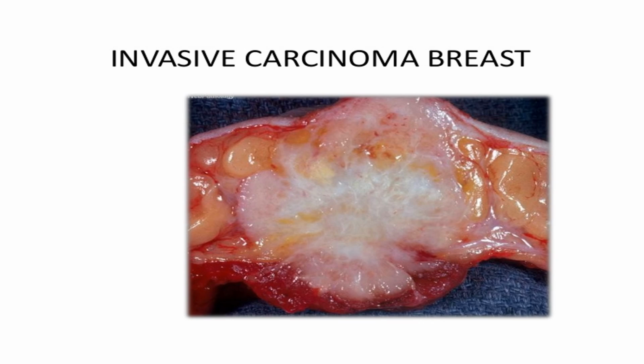Here is the gross picture of a breast cancer. As you can see, the borders of the tumor are ill-defined. So not like your benign tumors, which are well-defined.